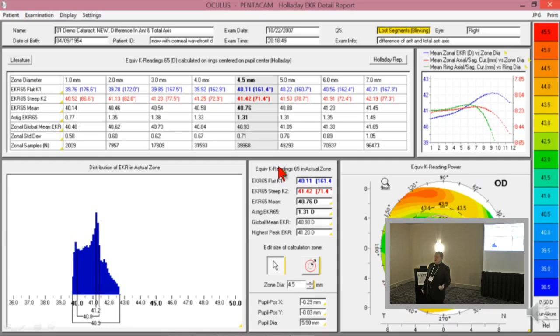They always come out with a hyperopic surprise because the cap, he doesn't look halfway between 44 and 49 for a 46. He looks through the 44. And then when he looks up close, he looks through the 49. So the point is, it's the paracentral power, just like a bifocal lens. You don't look through the average of the bifocal part and the distance part all the time. You look through one or the other, and it's the same way when it's on the cornea. Okay.